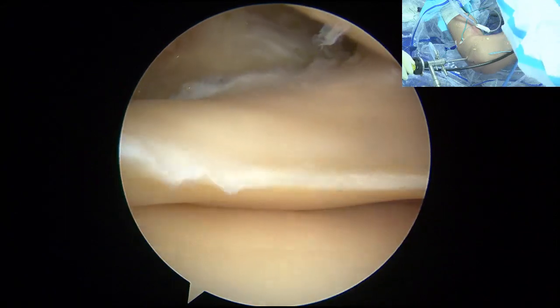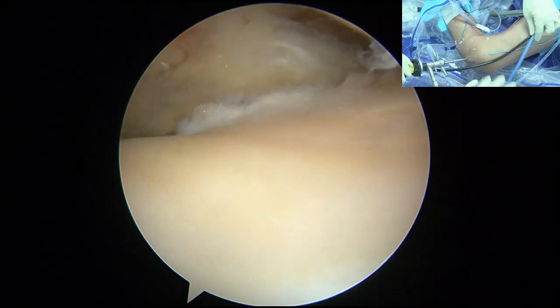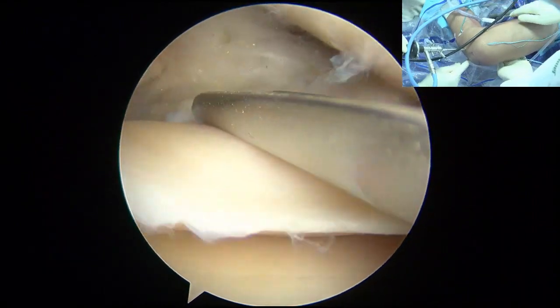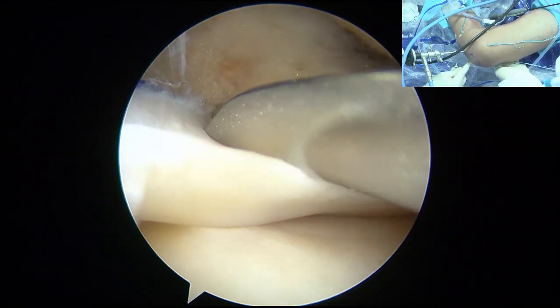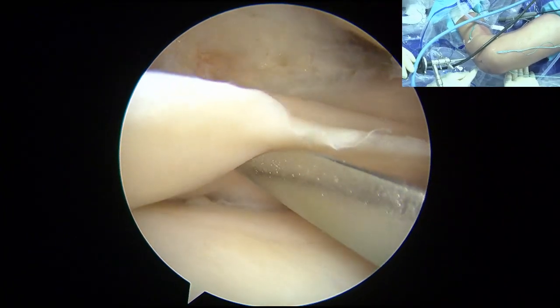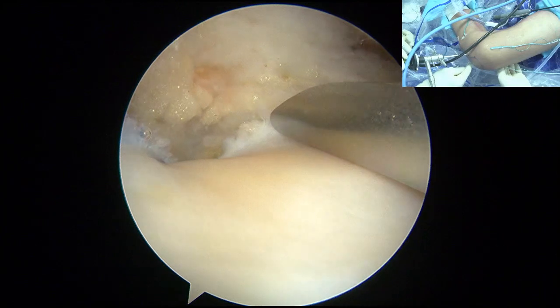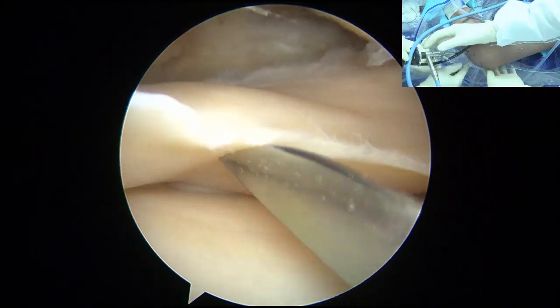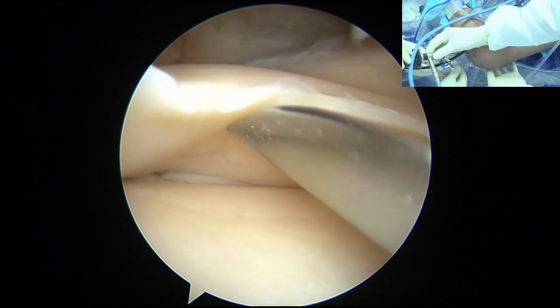因为今天我们已经重建了ACL了，所以关节是比较紧。那如果真实病例的话，半月板伴有ACL损伤的话，这个显露不成问题的。Okay, so this area, okay? So here this area, this is a radial tear. It's always this area, okay? The radial tear. 我们就认准了这个放射状撕裂的经常发生的位置。Okay, good. So I repair the undersurface first.